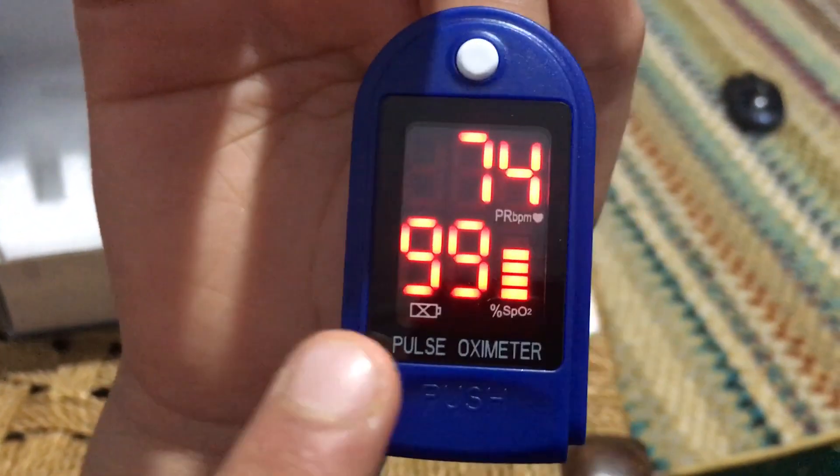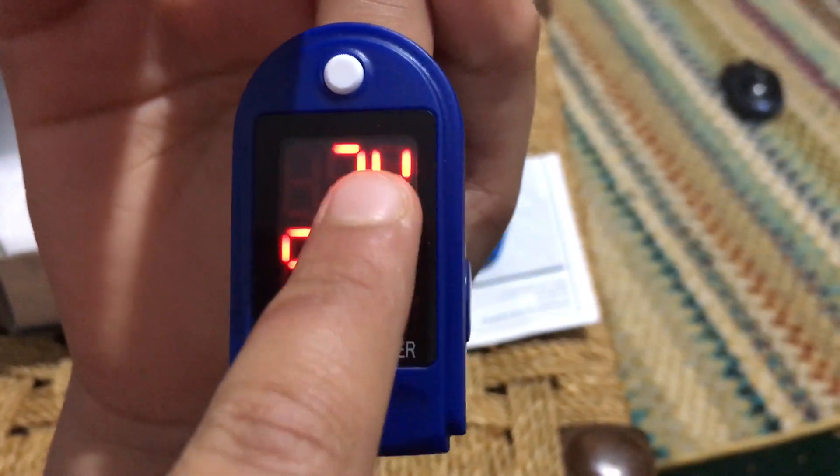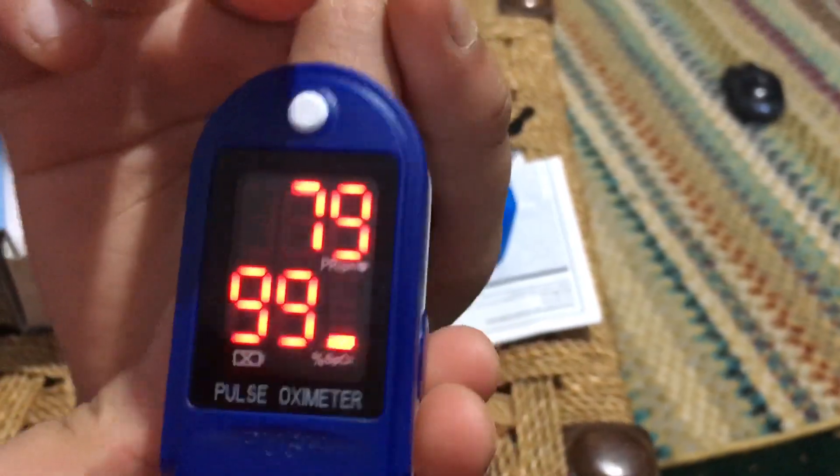So this is my 99 for the oxygen level, and this is my rep - how much it is beating. Thank you guys for watching - bye bye bye!